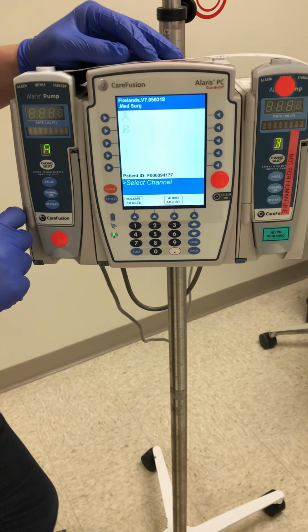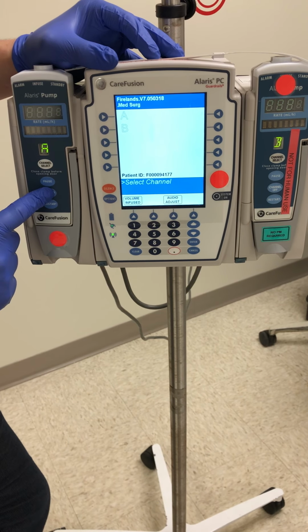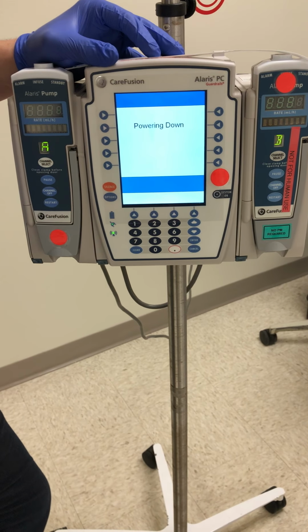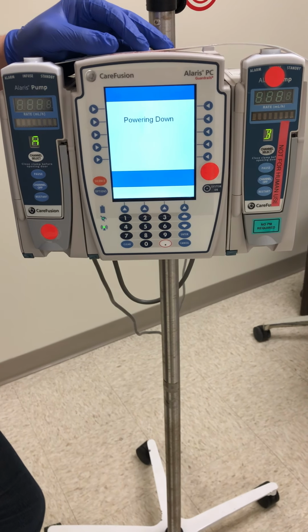To power the machine off, you can go to either channel and just hold in the channel off button. Hold that in, system will power down, and that's a basic overview of the Alaris IV pump.